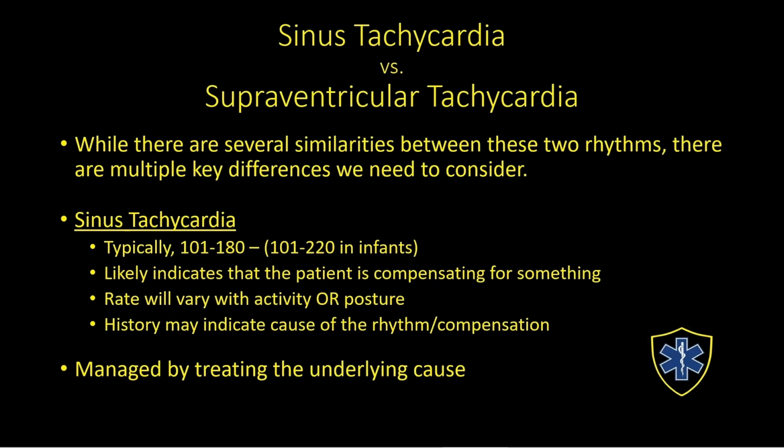Now, this likely indicates, as we said before, the patient's under stress, physical or mental stress, that they're compensating for, hypovolemia or hypoxia. The body is trying to do something by elevating the heart rate in that first stage of compensatory response. One key difference is sinus tachycardia. The rate will likely vary with activity or posture. So if the rate is the same lying down flat as it is sitting up as it is standing up, that would lead us to believe that the rate's not going to vary with posture.